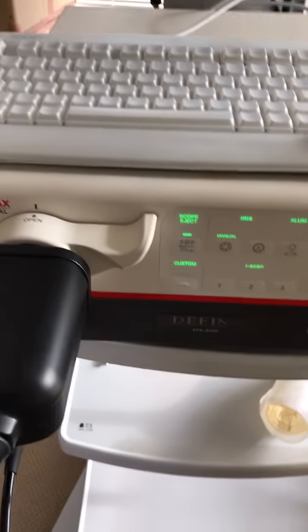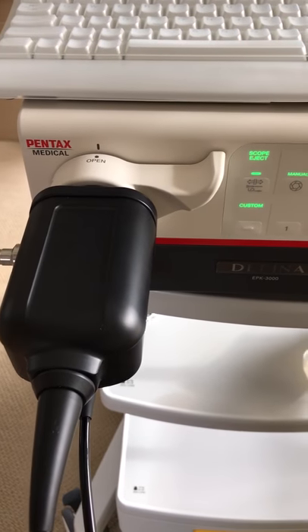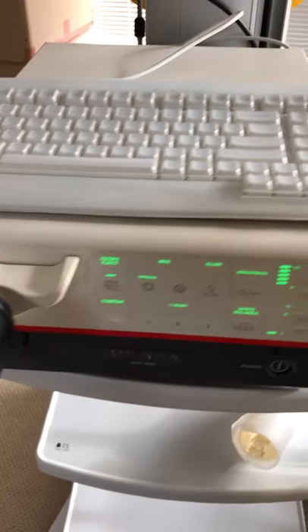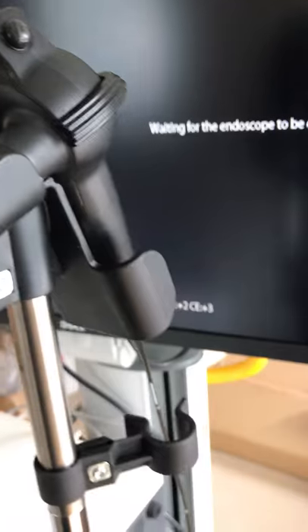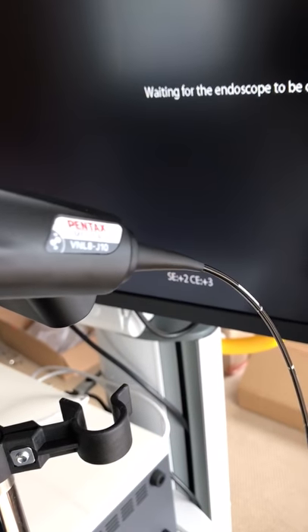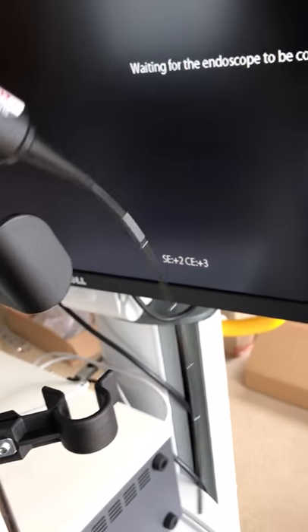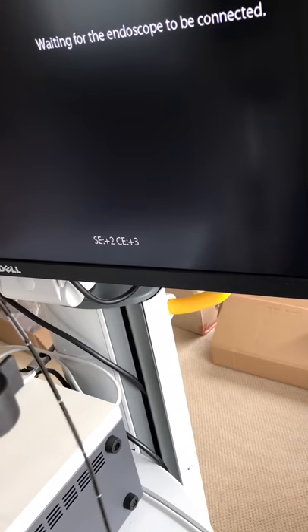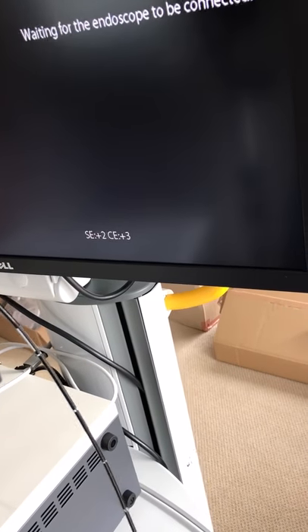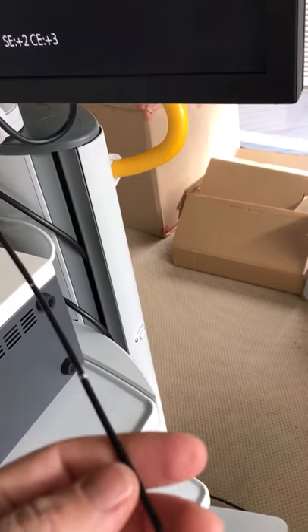This is an HD camera processor for your videoscopes — flexible videoscopes. I've got one attached, and the videoscope we have here is the brand new, hot off the press, HD VNL8J10.